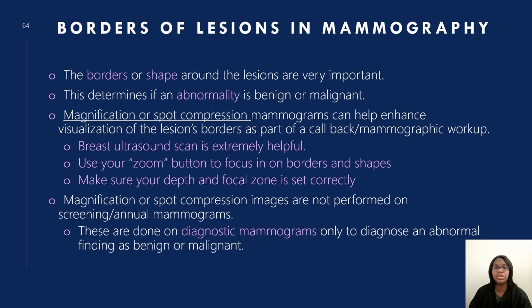So with the borders in mammography or breast ultrasound, we like to make sure that we are measuring correctly. If a patient is in mammography, then you use magnifications or spot compression to just make sure that you can see the borders and the lesions correctly.